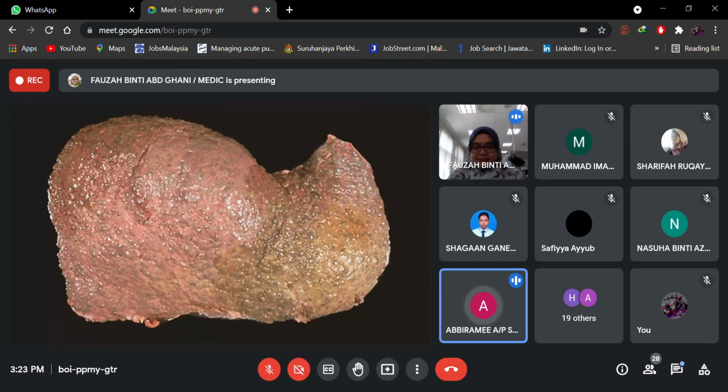It looks more greasy, brown. Okay, so some greasiness. And how about the coloration of this area? It looks a bit brown. Brown, and do you think there's a greenish tinge in this area? Yes. All right. So why do you think there's some greenish discoloration? What could have accumulated? Is it due to the necrosis? No, not really.